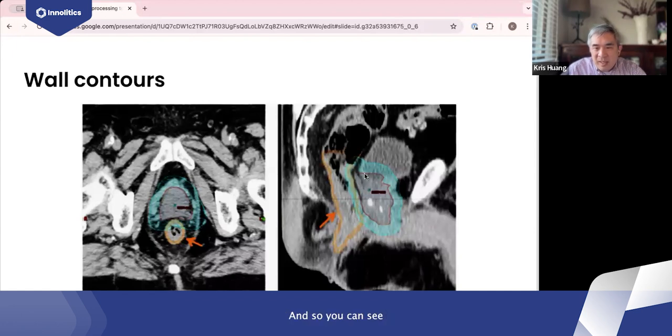As you can see, we're going to blast this prostate to a pretty high dose, and the rectum is sitting right behind it. Over the years, there's been some debate over how we should contour this structure, because the easy and standard thing to do would be to just contour the whole thing. But we honestly don't care how much we radiate what's inside the rectum. We really care about the wall of the rectum.